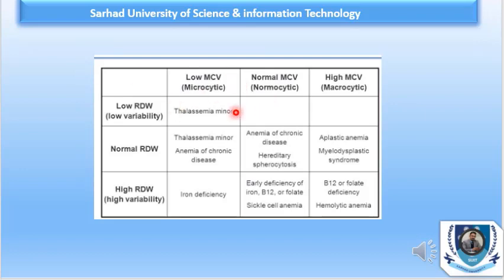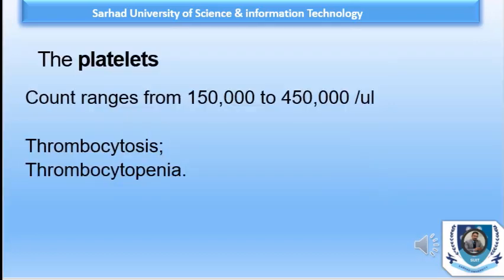This is an important picture. So after discussing red blood cell, hemoglobin, PCV, then MCV, MCH, MCHC, and finally we'll get RDW. These are important diagnostic tools for identification of any disease like anemia, whether it might be macrocytic, microcytic, or a normochromic normocytic anemia. On the basis of these parameters, we can easily understand which sort of anemia we have.